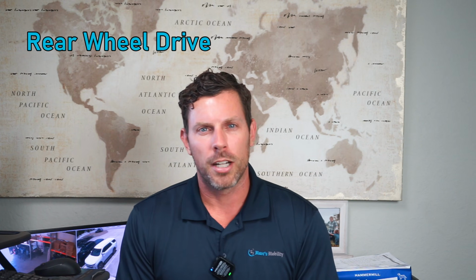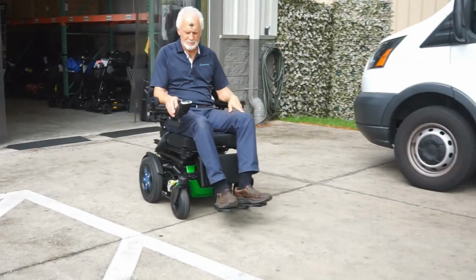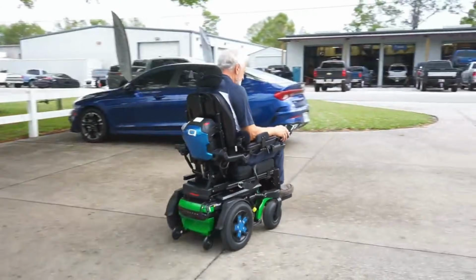The next drive configuration we're going to go over is the rear wheel drive. Now, rear wheel driven units are pretty normal in folding units and a lot of other products on the market.